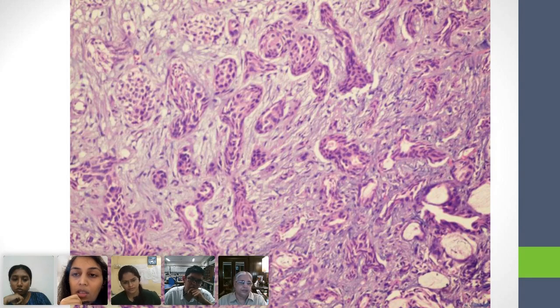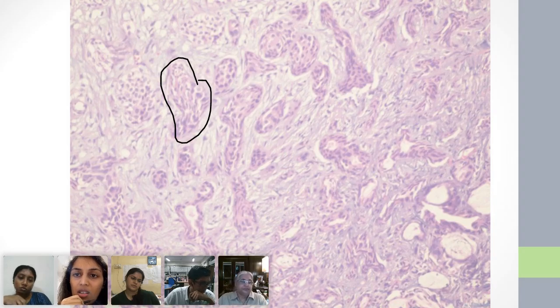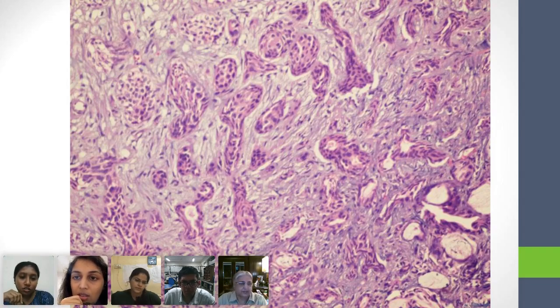Ma'am, I think there is a lot of fibrosis around. Fibrosis, okay. It's probably compressing the ducts, and that's why they're flattened. Ma'am, in chronic sialadenitis, the ducts get obliterated. But aren't they very peculiar? You saw nice lumina here. Look at the cells. Don't you see that they look spindly? And some have clear cytoplasm. Well, the cytoplasm may be clear, but the nuclei are very dense and very spindly.